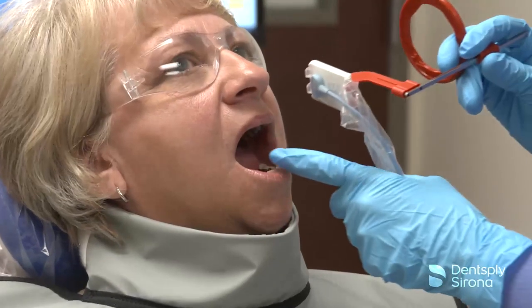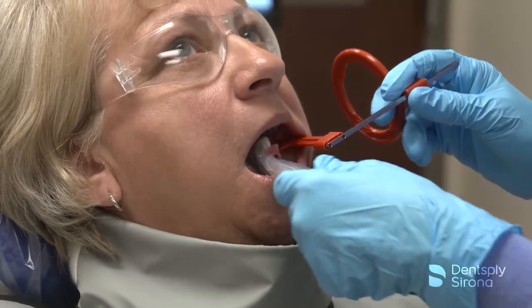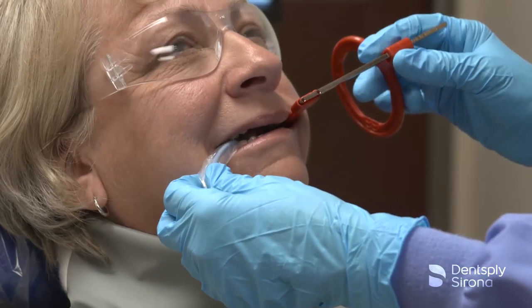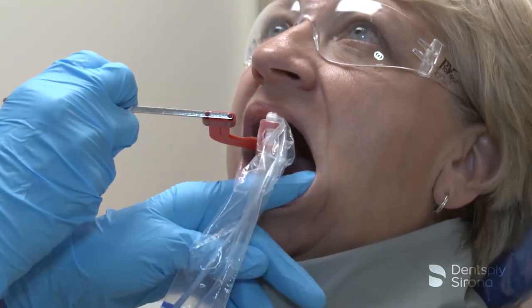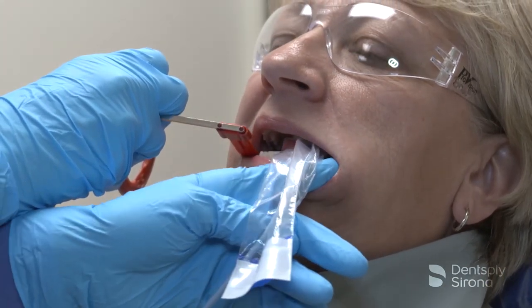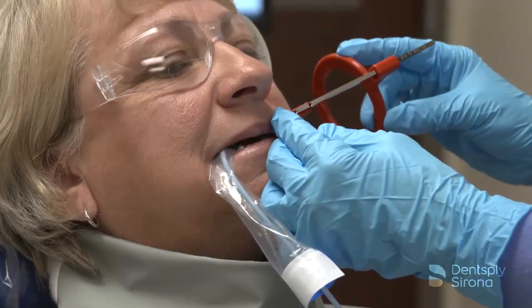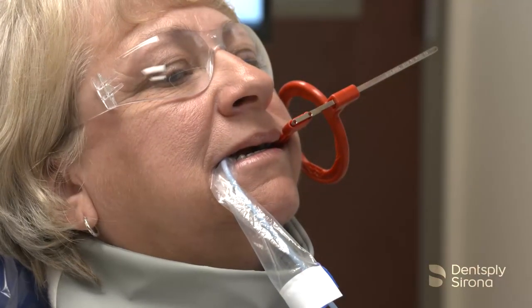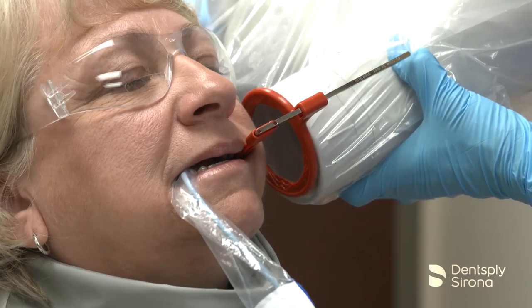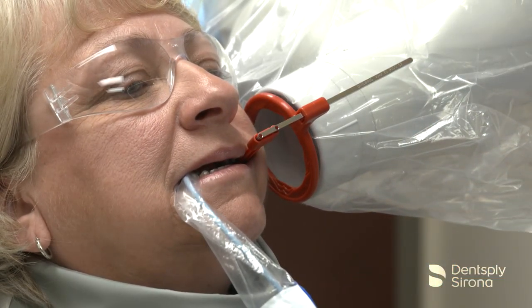Similar to the premolar bitewing, the central ray must be perpendicular to the image receptor when placing the molar bitewing. It is essential to include the distal-most portion of the second molar, or third molar if present. When placing the sensor, allow the sensor to find its way in the mouth, and just prior to having the patient close, gently shift the holder as far distally as the patient will allow. Once the bite block is in place, slide the aiming ring down the arm close to the patient's face, align the tube head, and the X-ray image is ready to be captured.